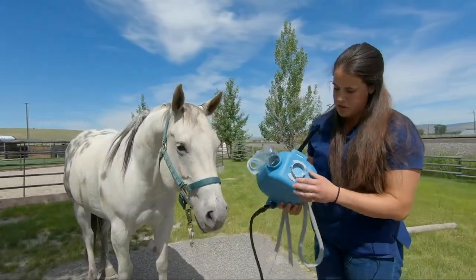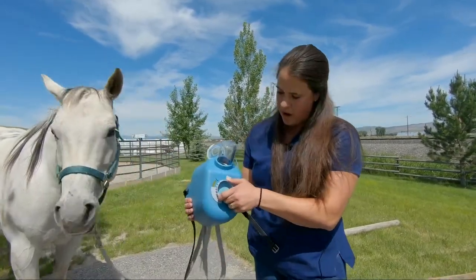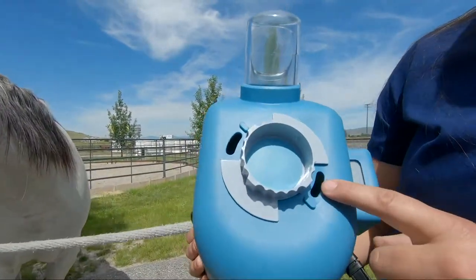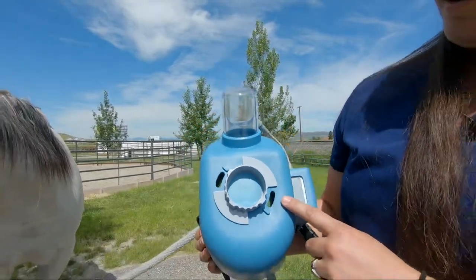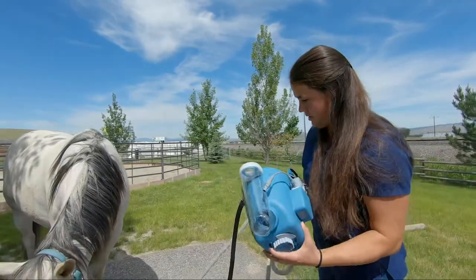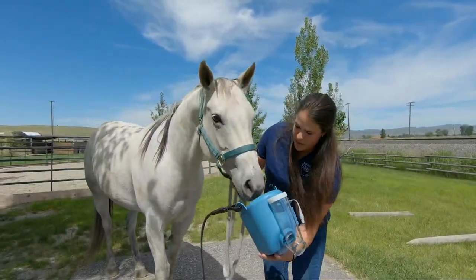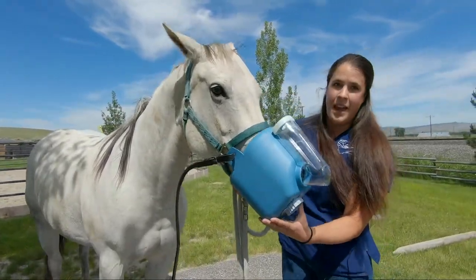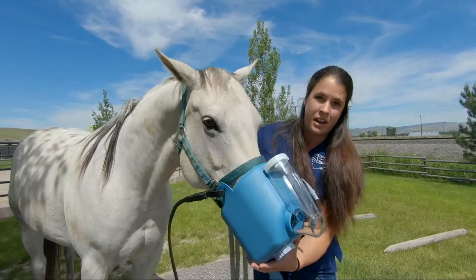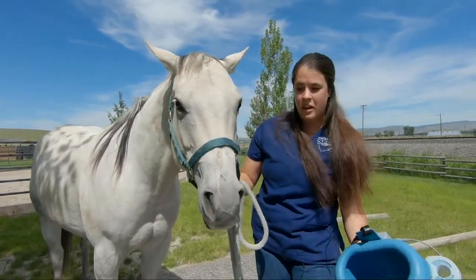Another thing that you can do is there is a dial at the bottom, and you open that all the way so that there is a way to breathe, so they don't feel claustrophobic when they have it on their nose. So first off, you just set it in their nose like this. Good girl. Then you just hang out with them for a little bit until they kind of get used to it. You can take it on and then try it again.